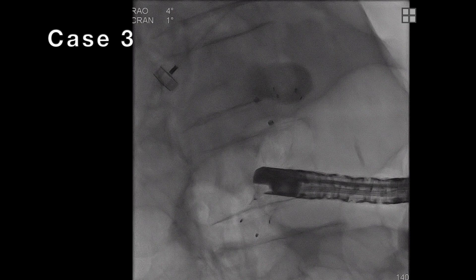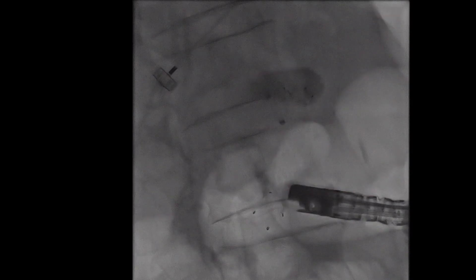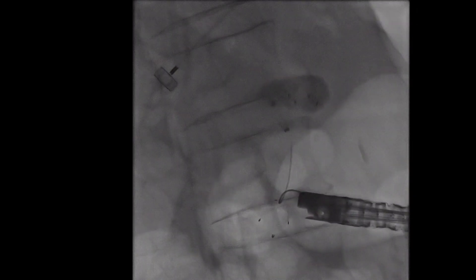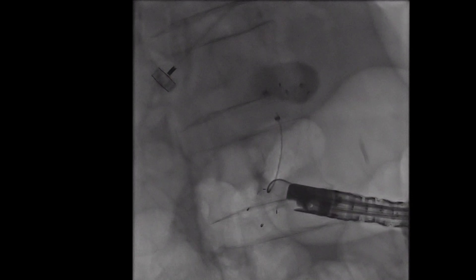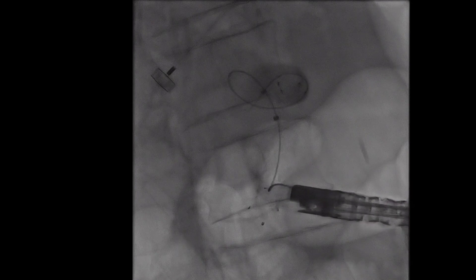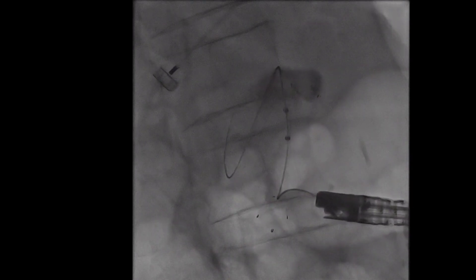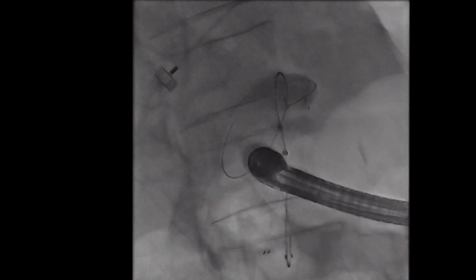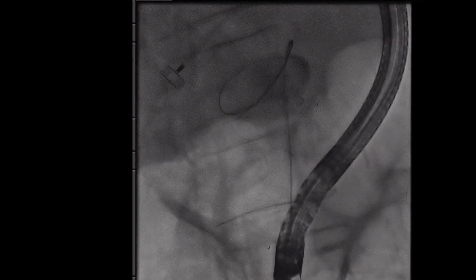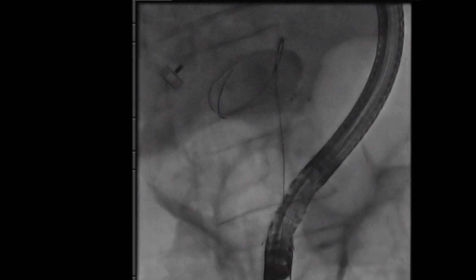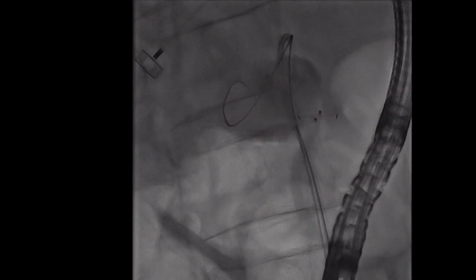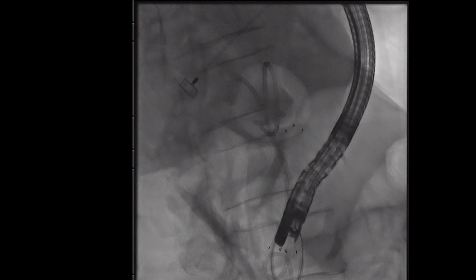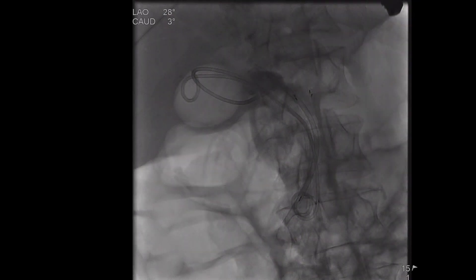In this technically challenging case in a patient with an indwelling uncovered metal stent, selective cannulation was achieved but deep access to the gallbladder proved challenging. Oftentimes multiple maneuvers are needed to navigate a cystic duct, which can be significantly strictured in patients with acalculous cholecystitis. This clip shows changes in scope position and advancement of the catheter with significant bowing to achieve optimal force vectors. Once access to the gallbladder was obtained, dual wires were placed using the cytology brush catheter system as previously described, followed by deployment of two parallel plastic stents. Re-accessing the gallbladder alongside an existing stent would have been quite challenging.